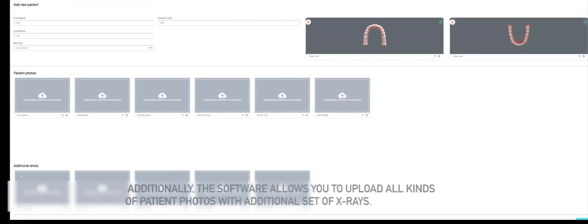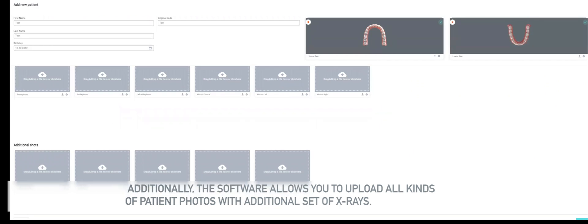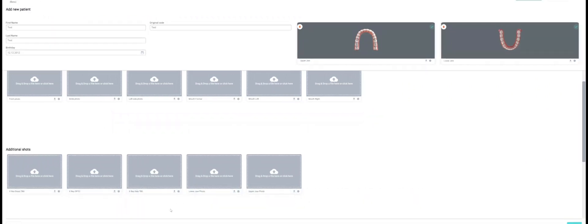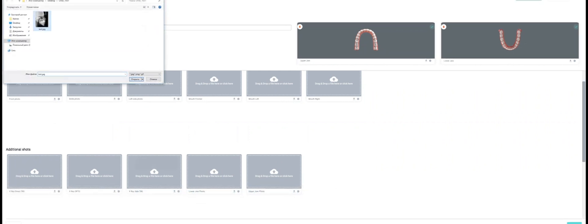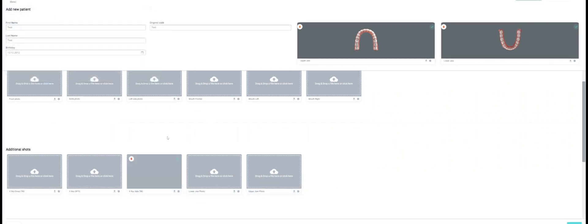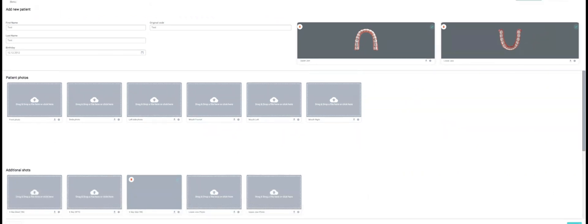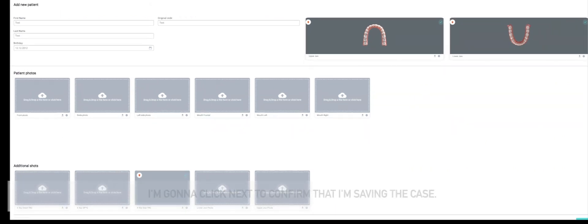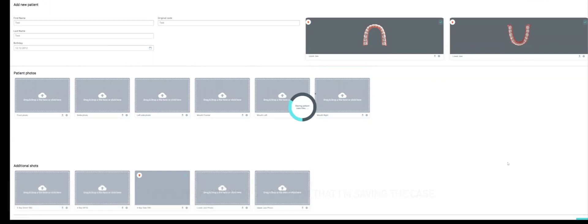For this demo I'm not going to upload all the images, but I will upload a single side TRG x-ray. This will help me demonstrate a feature we have later on. I'm going to click next to confirm that I'm saving the case.